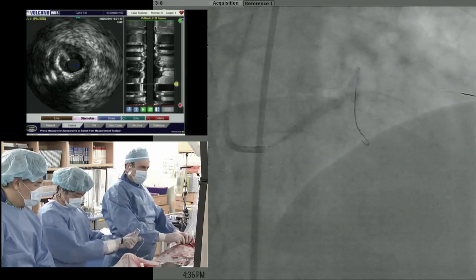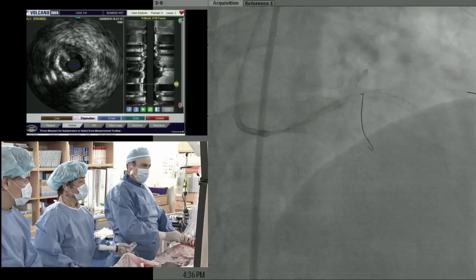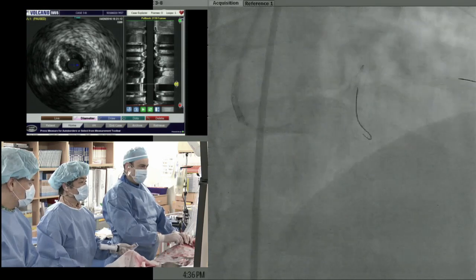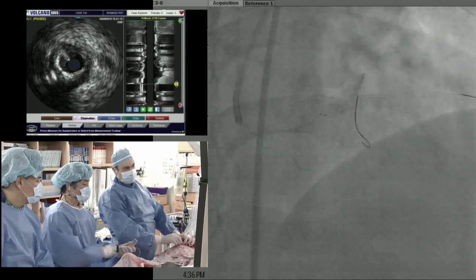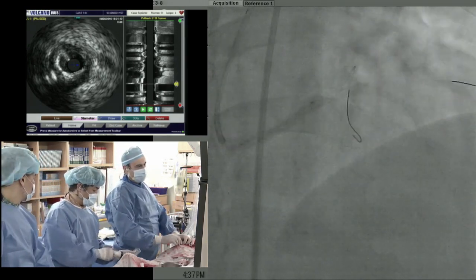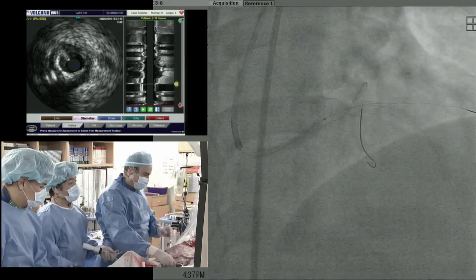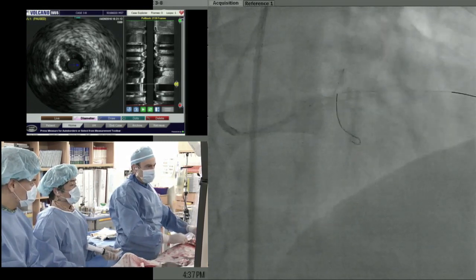Down. And go like 18 there or something like that. 18? 18, 20. Yeah. Down. Alrighty. Let's see what the damage is here.